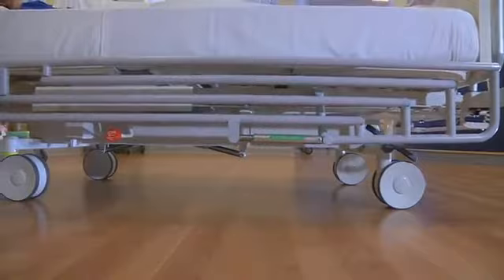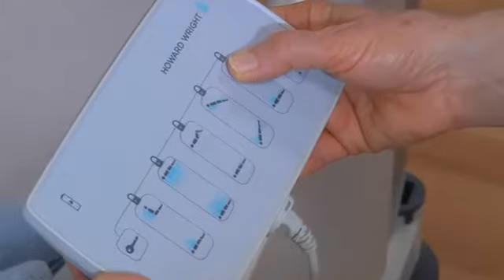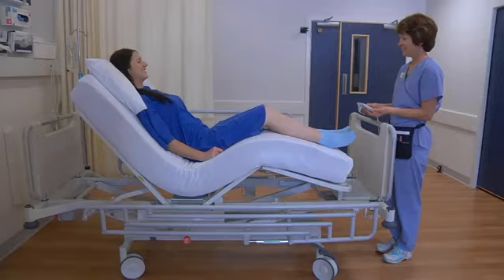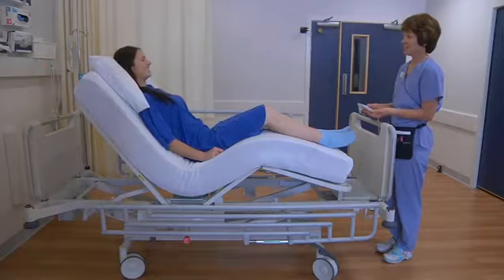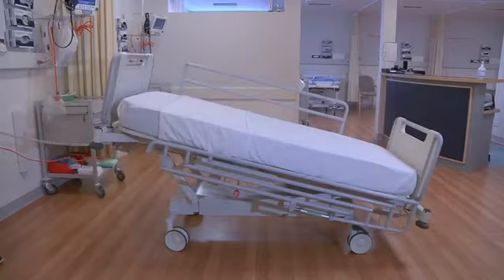Straightforward and practical to use, the M9's fully electric functions are intuitive to use and require minimum training. Using either the patient controls or the attendant control handset, the M9 can be configured into a full cardiac chair with sliding backrest and leg raise, and into Trendelenburg or reverse Trendelenburg positions.